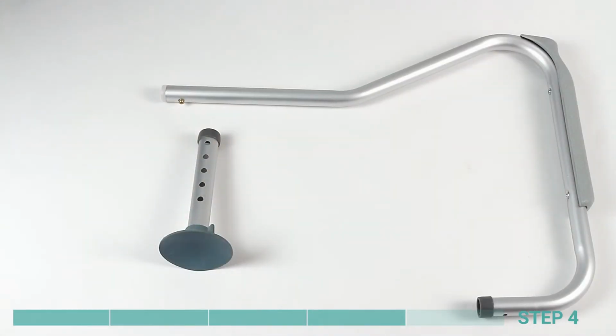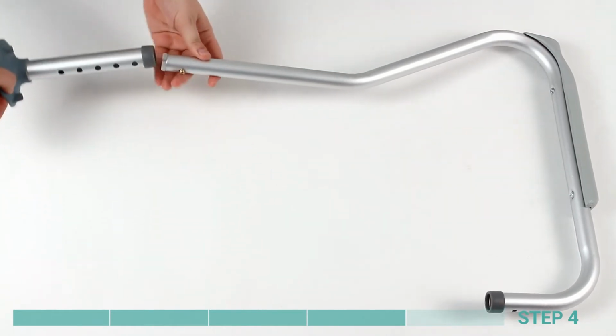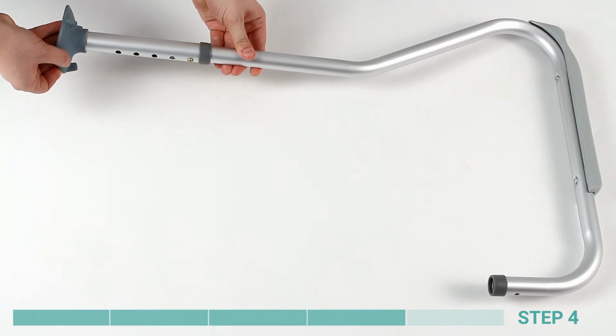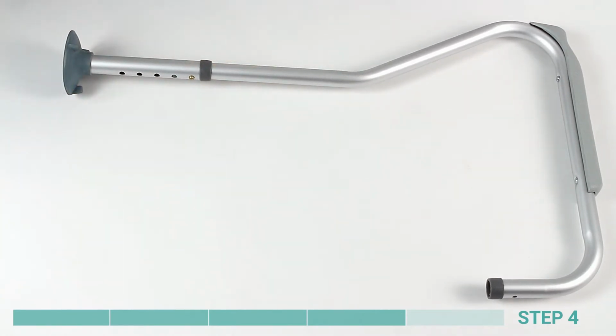Step 4. Attach leg extensions to bottom of armrest rails. Align locking pins with holes in leg extensions and adjust to desired height.